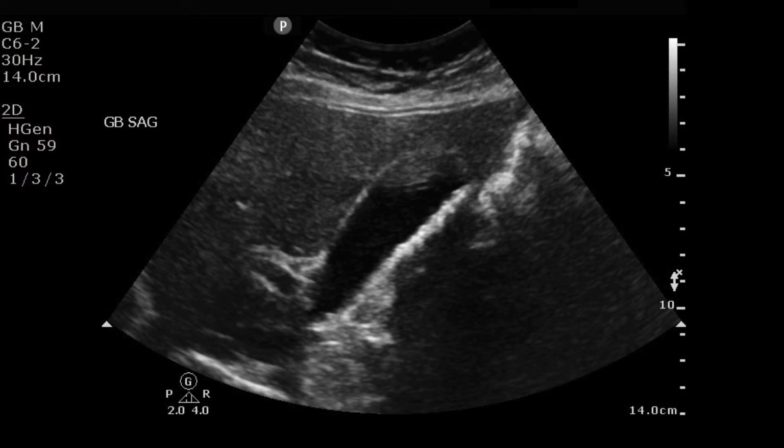And right in the middle, we see the gallbladder, right? And we have this bright line at the posterior portion of the gallbladder, which is the stones inside the gallbladder. So that reflects a profound degree of acoustic impedance difference between the fluid in the gallbladder and the stones. And so it's going to reflect a lot of that sound energy and have a deep dark shadow posterior. And then even on the sides, we see some air that has the bright line with a very grayed out or dirty looking shadow. So here's the air, here's the stones, the diaphragm, and then obviously the liver right in the middle.